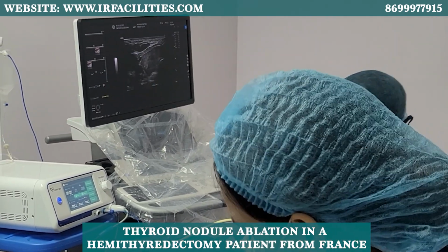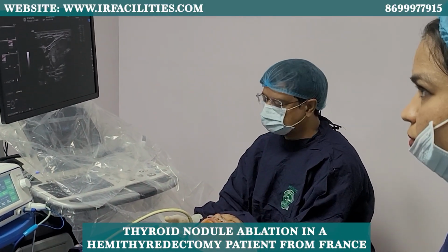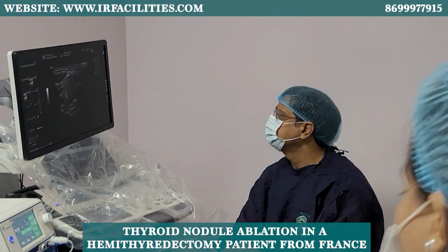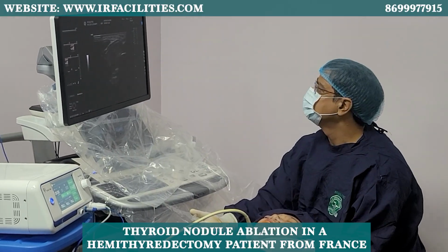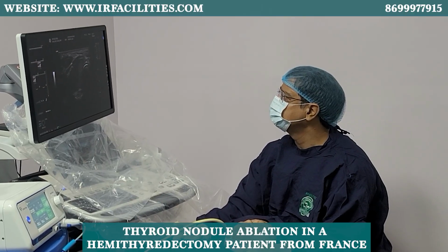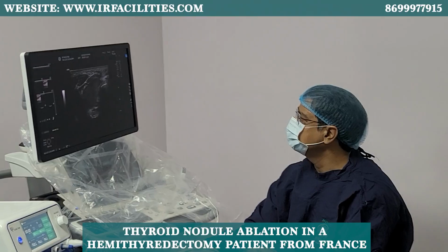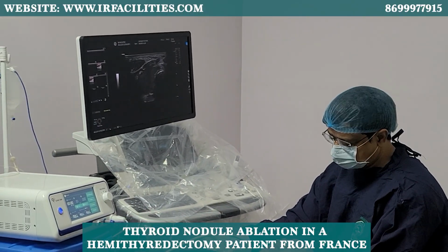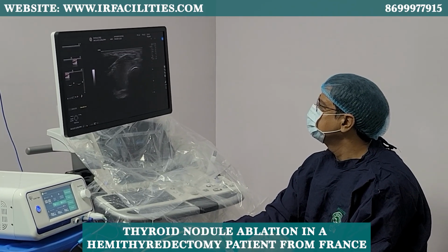So she's not talking to me, she's a little scared, or maybe she has had anesthesia. I'm till the capsule now. Also, she also had some hoarseness of voice before during her previous surgery. Now we're going to ablate.